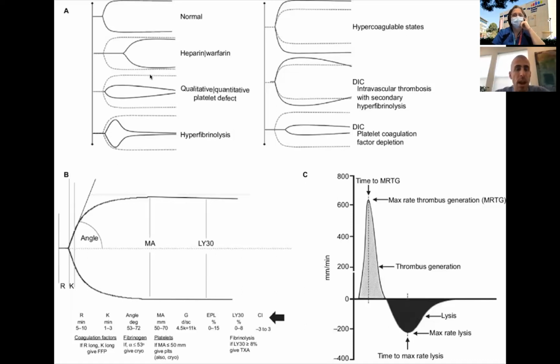Okay. This second one here, look at this. So the clot forms in a normal amount of time, but it never gets that big. And then it kind of peters out quickly. Well, that's a problem with platelets.